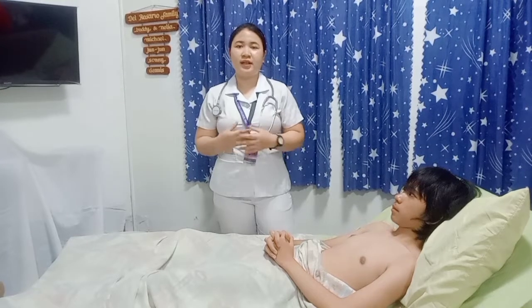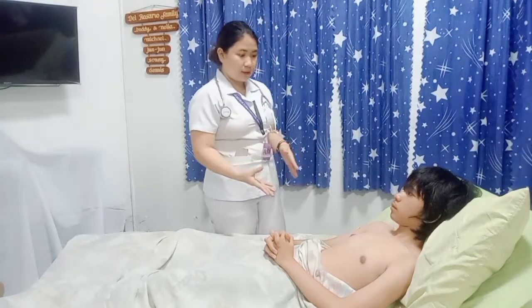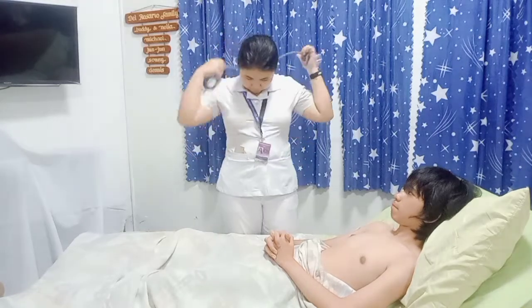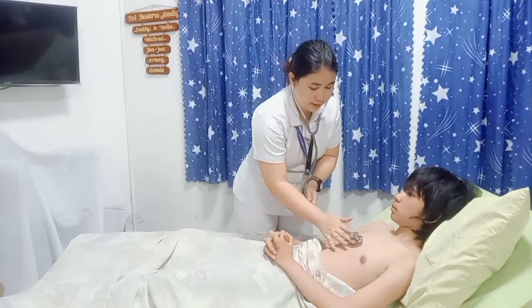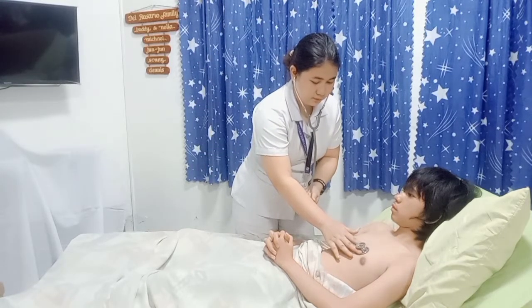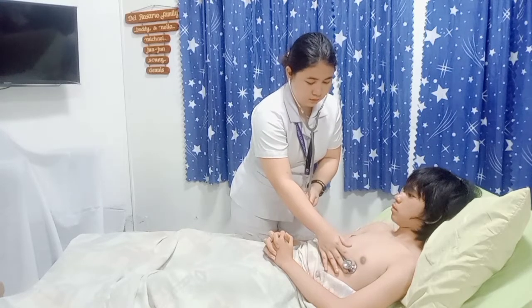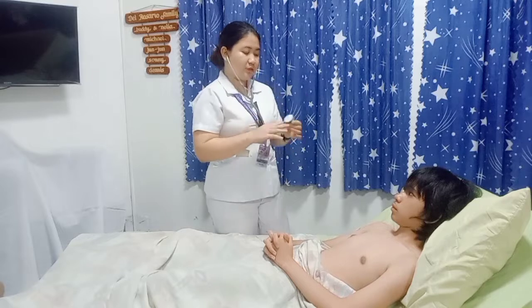So ask the patient to breathe regularly since breath holding will cause any normal or abnormal split to subside in the heart sounds. Okay, now Genesis, what I want you to do while I am auscultating in your chest area, I want you to breathe regularly, okay? Okay. So I'm going to use first the diaphragm of the stethoscope to listen for high pitch sounds, okay? I'm gonna start here in your area. Okay, now I'm going to use the bell side of the stethoscope to listen for low pitch sounds, okay?